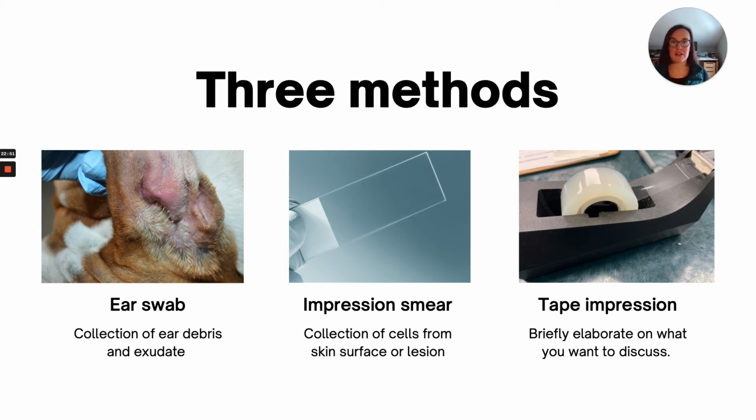Other diagnoses can come from an impression smear, like, again, I kind of hit on pemphigus, or certainly our T-cell lymphoma. In some cases, we can see a lot of lymphocytes in the skin. So your impression smear can tell you a lot.